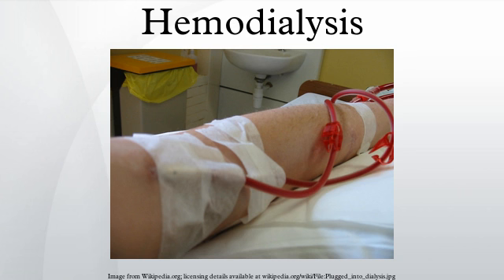Another was to mix in some compounds that would inhibit complement activation at the membrane surface. The original unsubstituted cellulose membranes are no longer in wide use, whereas cellulose acetate and modified cellulose dialyzers are still used. Cellulosic membranes can be made in either low-flux or high-flux configuration, depending on their pore size.